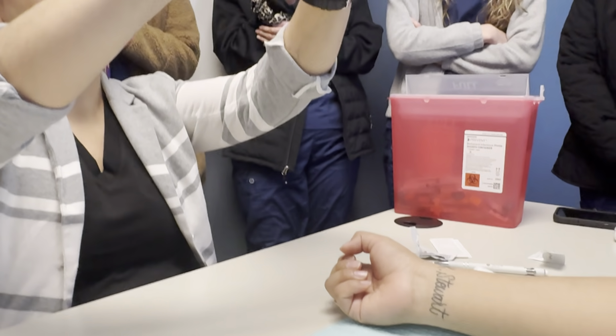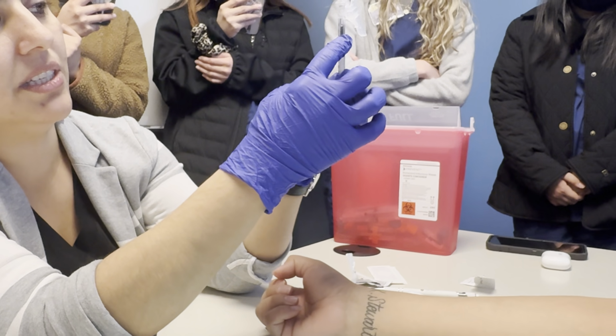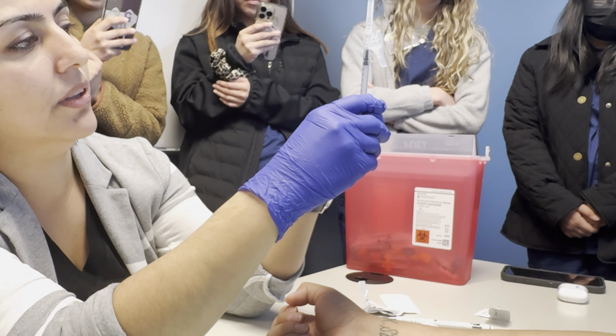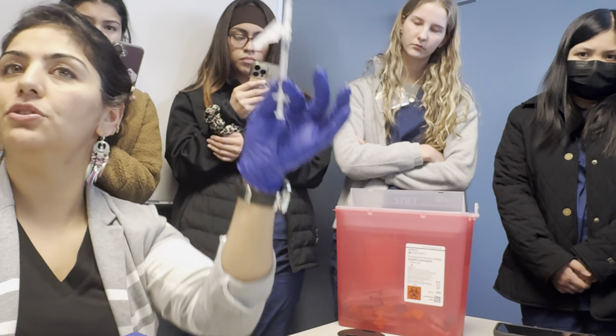And I want to hear a click. And then when that click is done, then I'm gonna go ahead and make sure there's no bubble in here. Do you guys see that little tiny bubble? We're gonna get rid of that. Click it. And then we're going to push to make sure that we get to 0.1 exactly, because we don't want to overdose or underdose our patient.